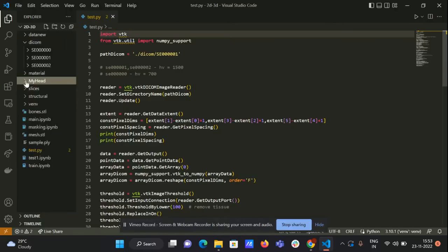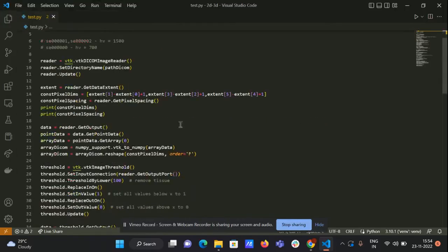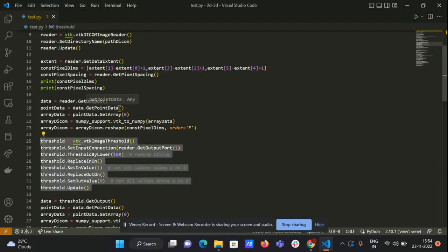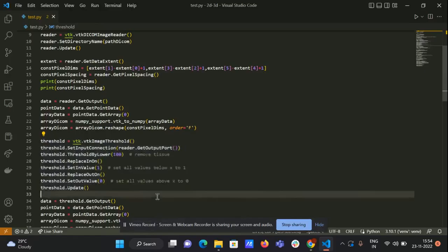images. As we know, MRI datasets are used for medical model training and testing, especially for working on the segmentation process. We go through the process of first building the point data cloud of the brain scans, after that we try to get the mesh out of it. For that, you can see that every MRI and CT scan is represented with a Hounsfield value, which is actually the intensity or the depth given to each point of the scans.